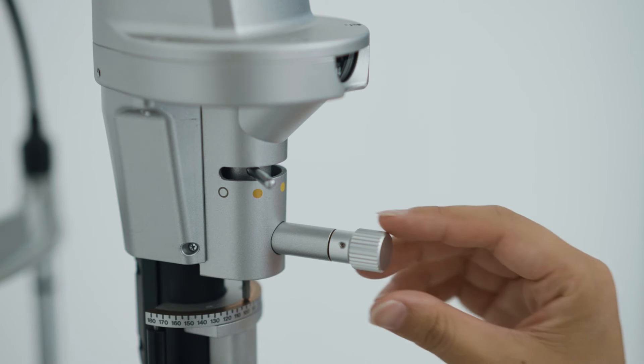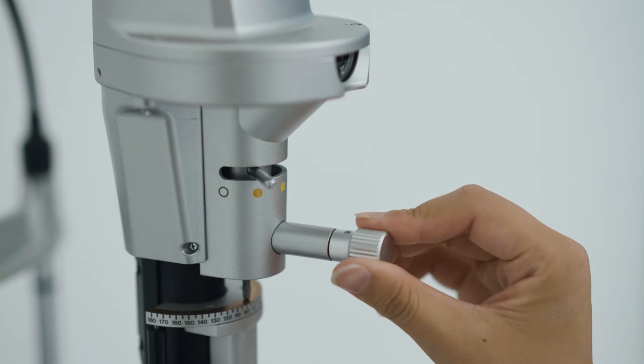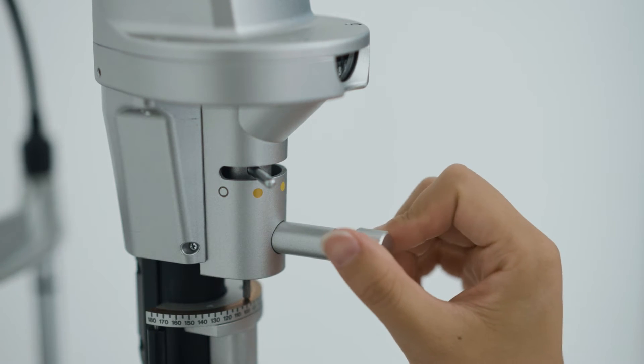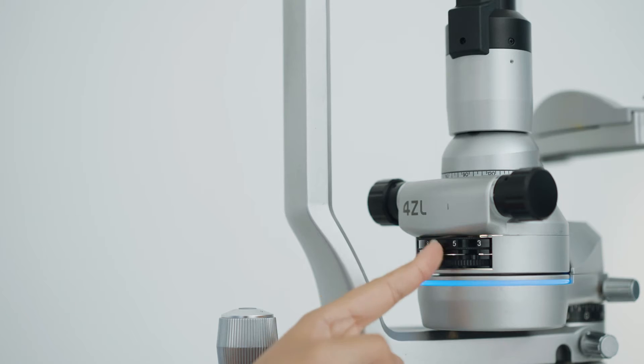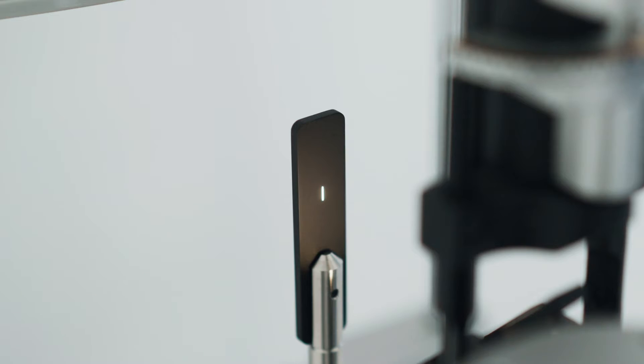Takagi's slit lamps are ergonomically designed. The pursuit of comfortable operability has resulted in the ideal size and location of various knobs.